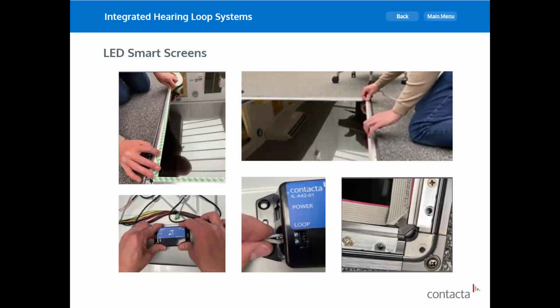It was a high quantity, and the manufacturer basically implemented that loop into all of their screens. So it's a nice ongoing sort of project, because it's required by law to be in all schools and universities, colleges, etc., in that particular country.